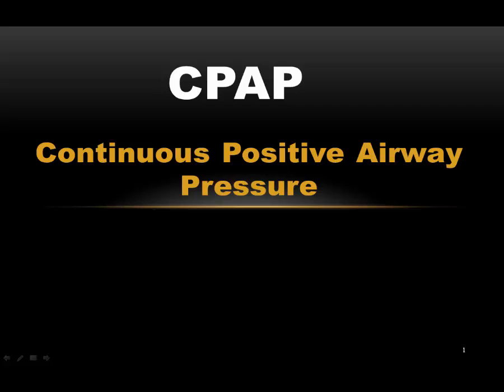Welcome to the Continuous Positive Airway Pressure Transition class. The term continuous positive airway pressure was coined in 1971 to describe an elevated airway pressure therapy for spontaneously breathing, intubated neonates. The current application has expanded to include adults and more recently patients without an artificial airway.